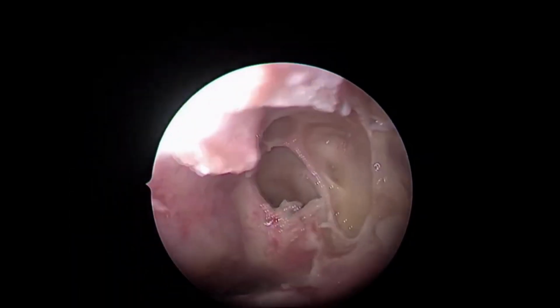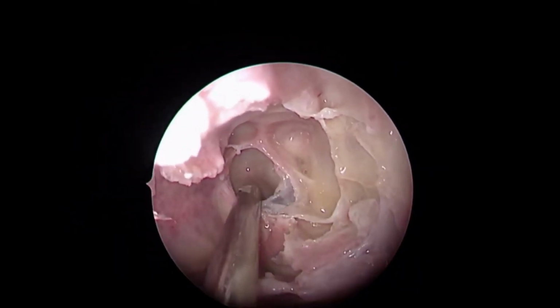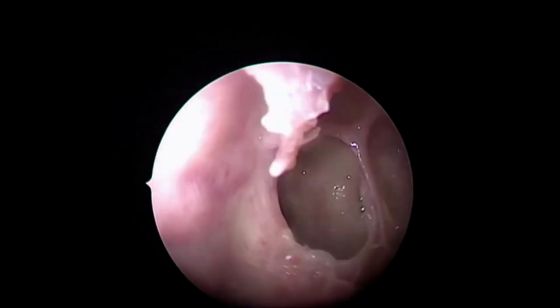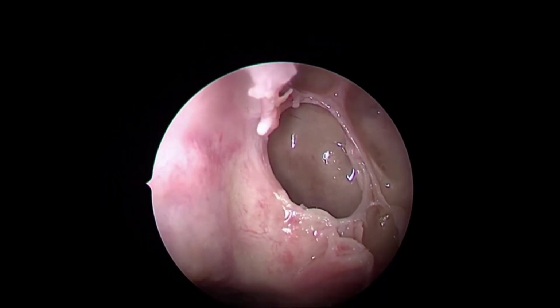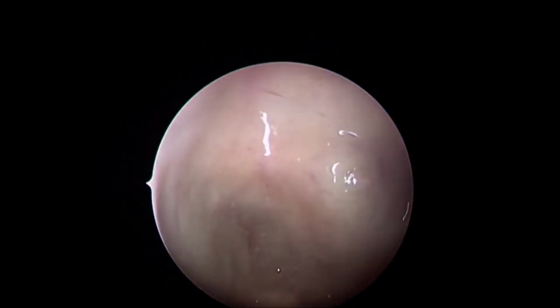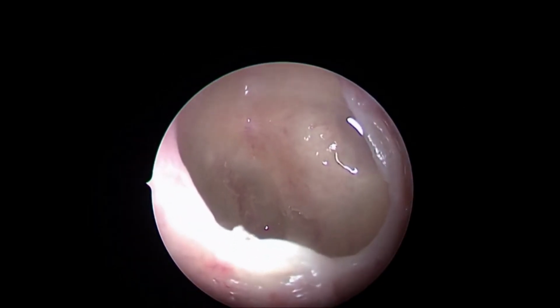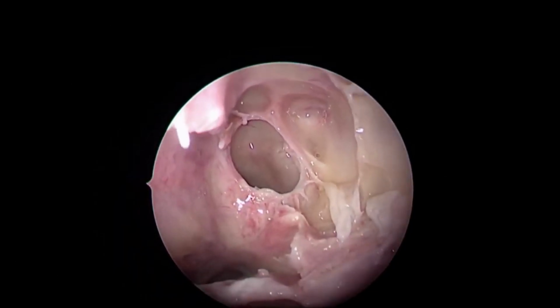This is again a very important dictum by Professor Stammberger. I have always attended his courses: do not use any sharp instrument inside the sphenoid sinus. The reason is, you can see what is there, the tiger behind, the internal carotid artery. See the carotid artery, the optic nerve, the sphenoid sinus.